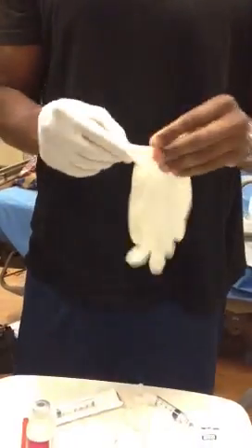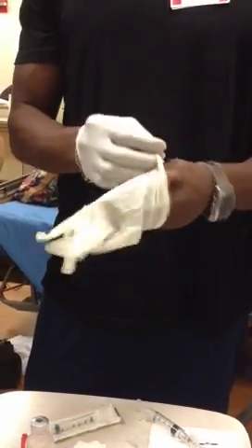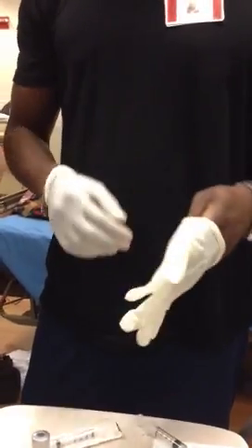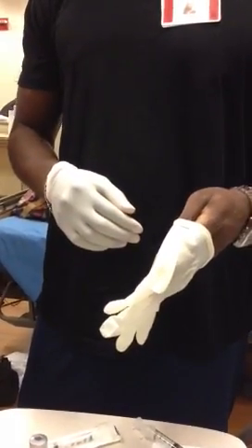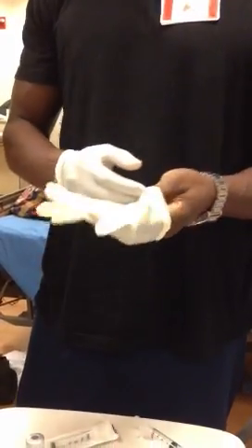Why is he not putting his gloves on when he's getting his equipment ready? Because they'll be contaminated. The whole point of the sterile gloves is to prevent the fluid from... The only thing you're using gloves for is for you not to get contaminated with blood, right? Always remember, think, why am I putting on these gloves? And then you know when to put them on. So the only reason is because you don't want to get HIV or something, right? Right.